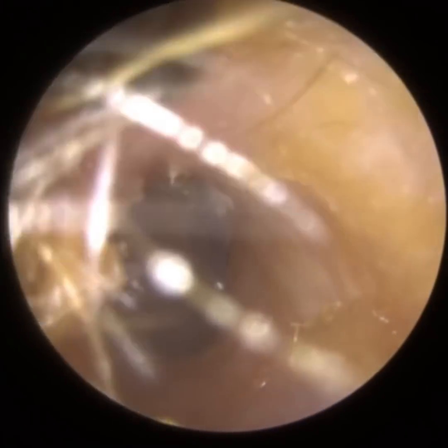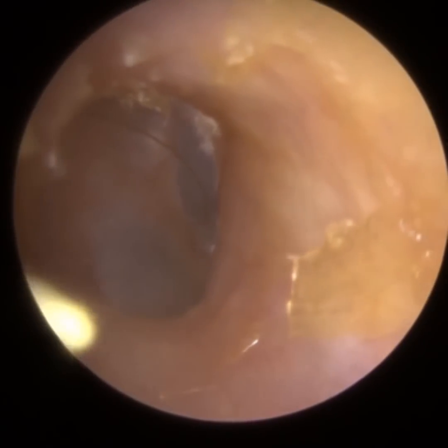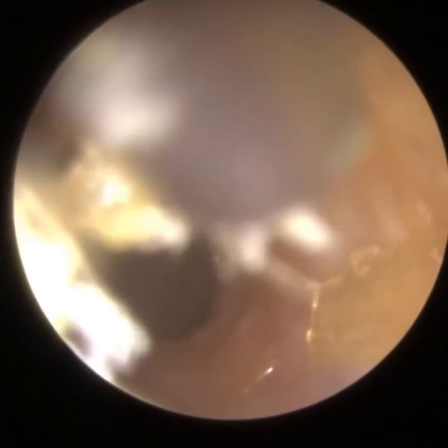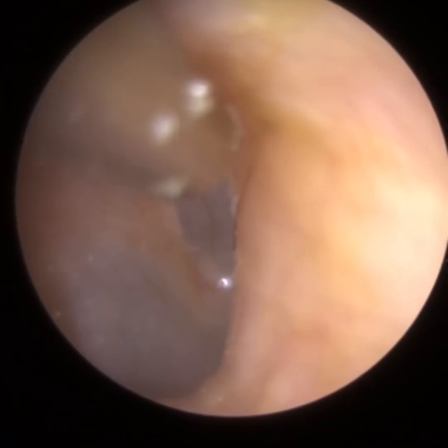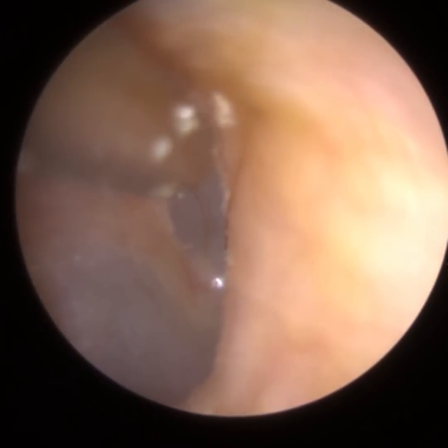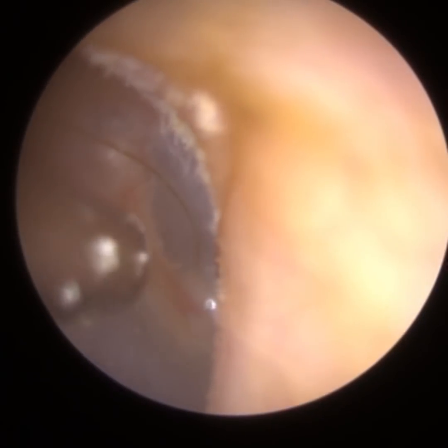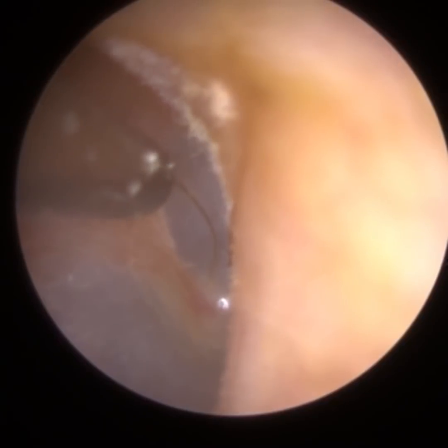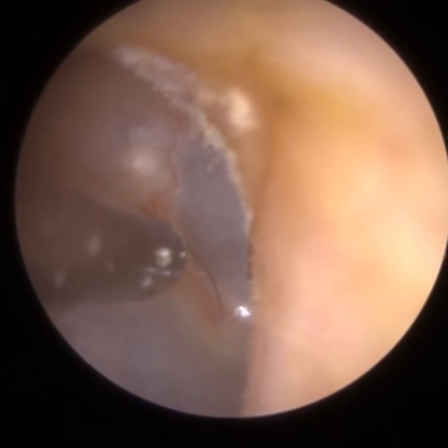It's too deep to use forceps because the tip of the forceps is a sharp edge, and that's so close to the eardrum. Just to approach it, to get the jaws around the strand of hair, would mean the distal end of the forceps, the pointed bit, will come in contact with the eardrum. We don't want that because that could potentially perforate it. So I'm just using a fine end here. You can just see I'm gently just on the canal wall. It's like a game of operation here. We don't want to make contact with that canal wall because the patient will flinch. And there's that hair that I've got no other option but trying to suction, but it's not going to come. It's not a problem. It's not causing them a problem. They didn't feel it in there.